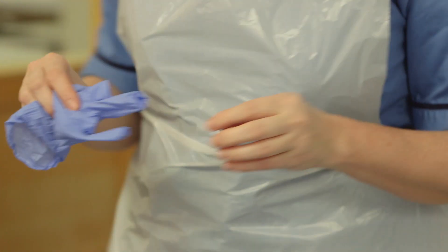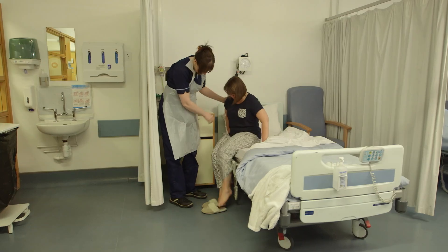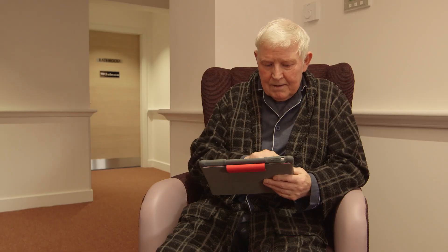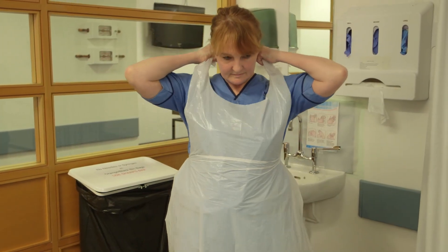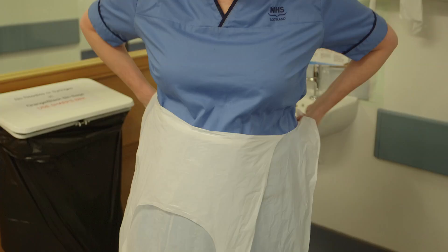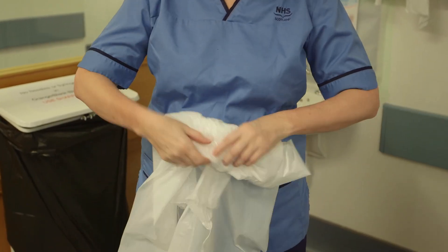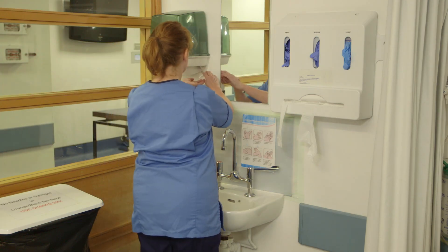Discard the gloves in the correct waste bin. In healthcare settings, dispose of PPE in a healthcare waste system. This may differ in care homes or a person's own home. Once this has been completed, remove the apron by breaking the ties at the neck and waist. Without touching the front of the apron, roll the apron inwards into a ball. Discard the apron in the appropriate pedal-operated waste bin and perform hand hygiene.